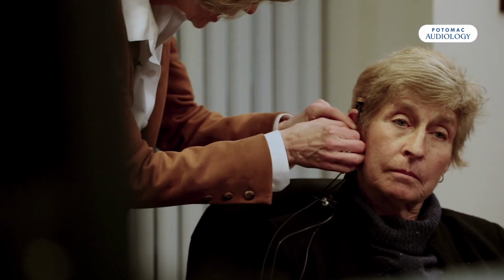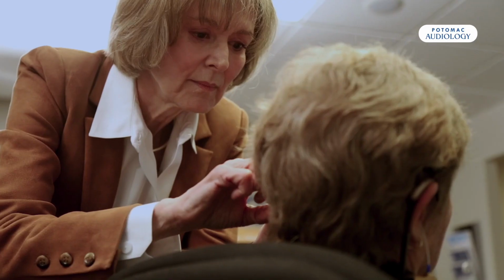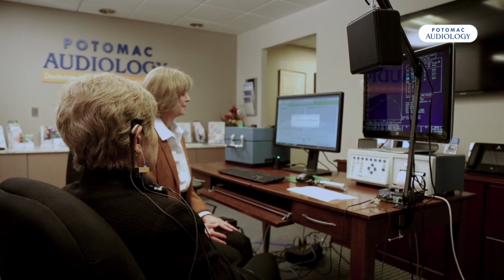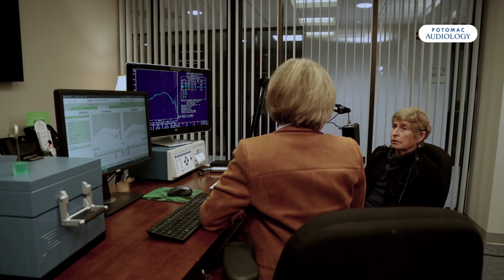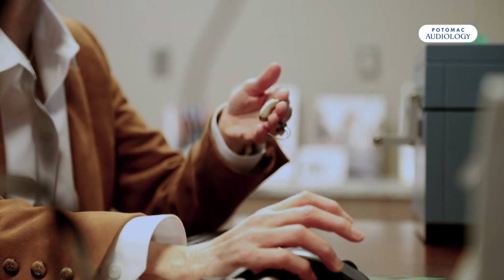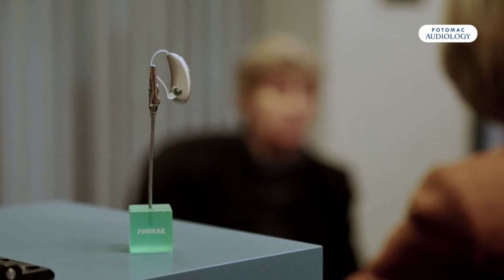The reason that we measure each ear individually is because the acoustics of each ear is different, and also the hearing loss can be slightly different. So therefore, we need to put the tube in there because that tube is measuring the acoustic environment of the ear itself. As a matter of fact, you can think of the ear canal like a little baby room.